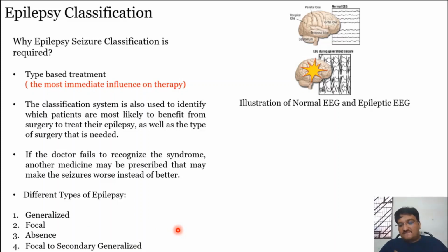That is the neurophysiological basis behind this, and we won't go into the detail, because the idea here is to let you know about the differences in EEG, so that if you can see the pattern by yourself, you would be able to at least detect that this person has epilepsy, or this person has this kind of epilepsy. So these are the four major types.